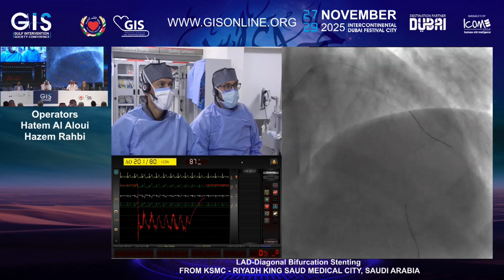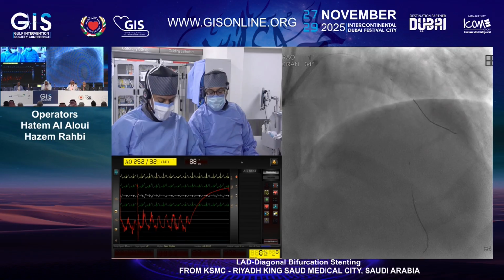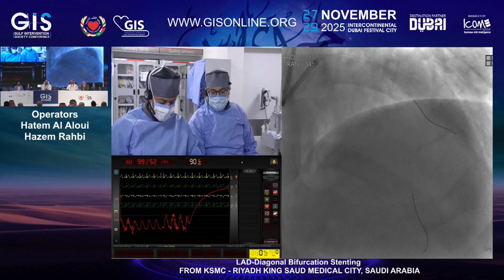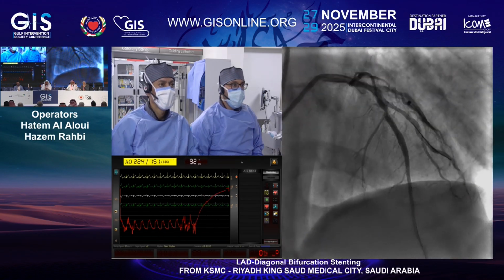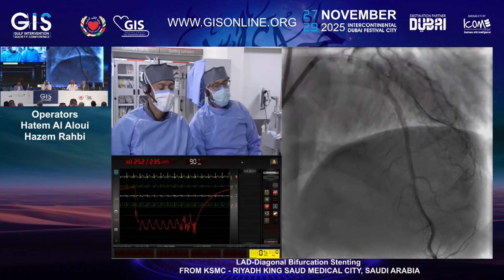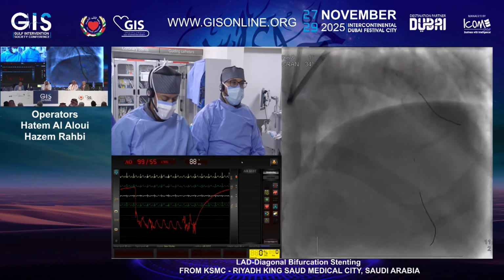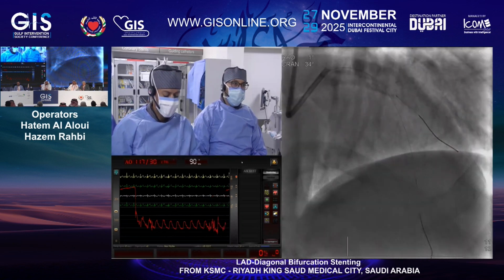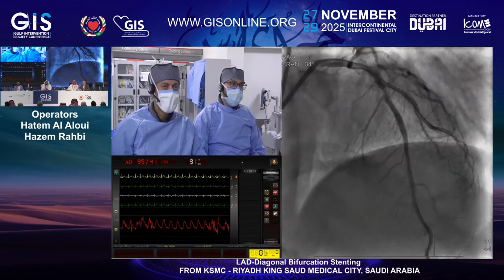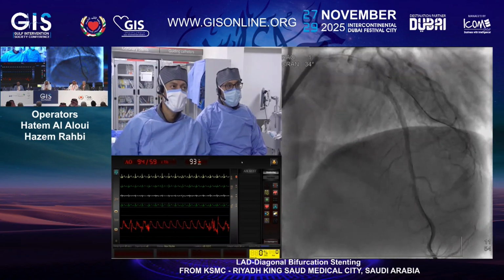Ready. Go ahead. What do you think? Looks good. Looks great. Yes, and it will grow anyway. I think we will have growth, absolutely. We don't have any dissection. The residual lesion is definitely less than 30%. So I think we can focus on the mid LAD.